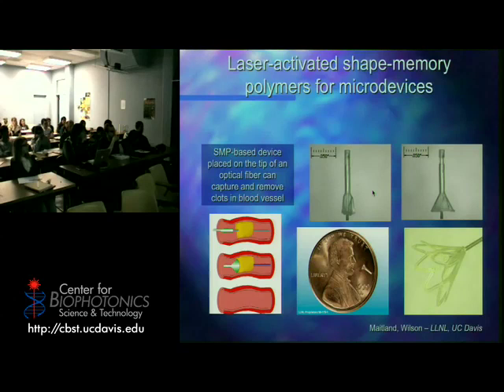Now, what about if you punch through and it breaks? Now you just created the problem further upstream. Now you created 2, 3, 4, 5 problems upstream. Okay? So the idea with the other techniques was blast the heck out of this thing, the clot, so it's so small that you are effectively causing tiny little strokes, but nothing that will affect on a large scale. But really, really small, tiny little blockages that eventually will clear out. Okay? That was one idea. So this technique, they tried making a wire that snakes through, so you punch it through, and then you activate it, and it becomes a spiral, and it grabs the clot. So they've tried a lot of different techniques.